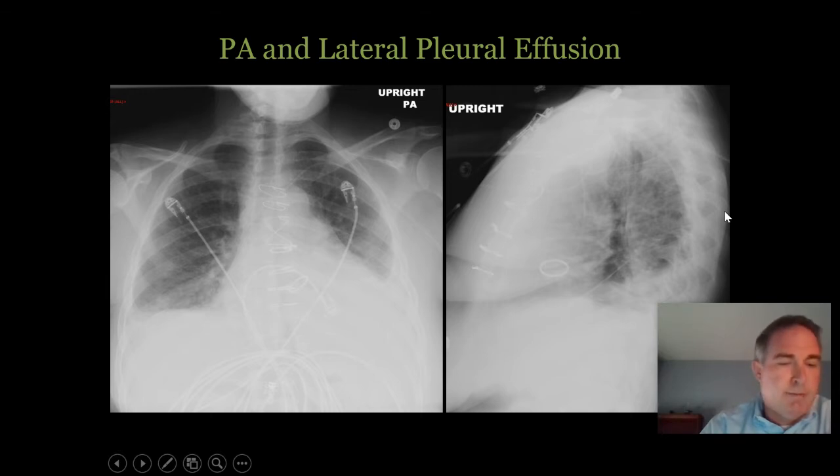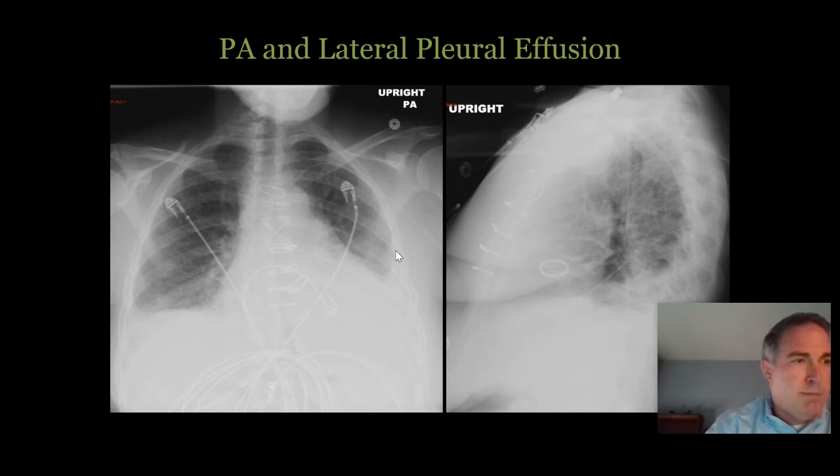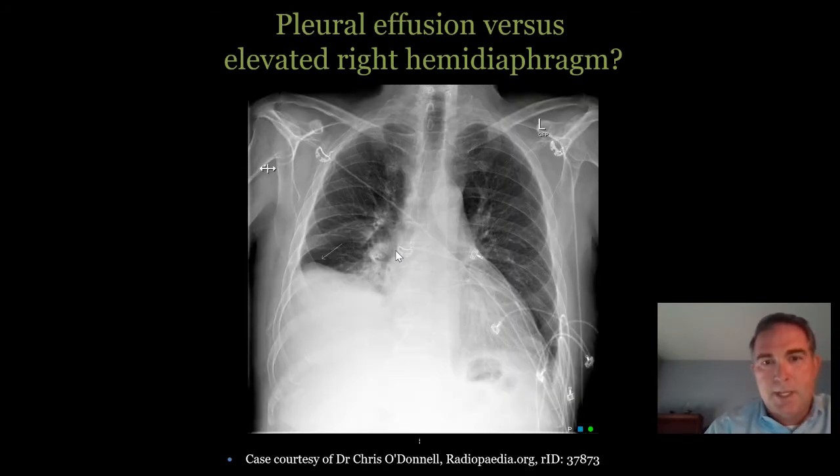And for me, moderate is say around this, filling up to around here or here, implying that if they're symptomatic, they should probably do something, thoracentesis or chest tube. Small, really not going to be able to intervene and shouldn't need to. Large, you should probably intervene regardless if they're symptomatic or not. That's how I judge small, moderate, or large.